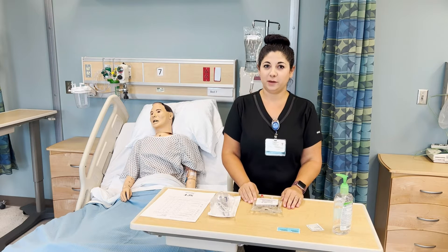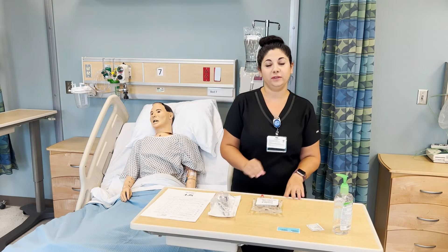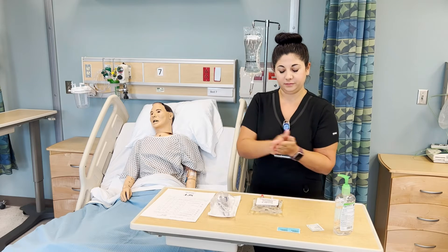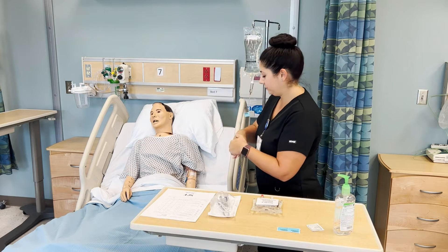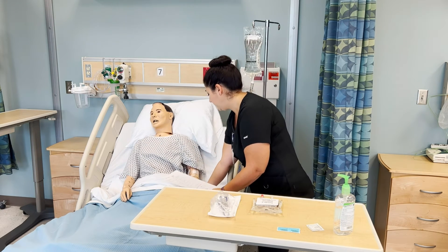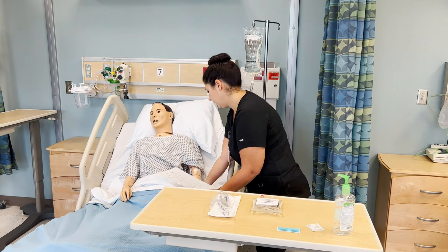I have knocked on my patient's door, entered, introduced myself, and explained to my patient that we are giving an IV piggyback medication. I'm going to wash my hands and identify my patient, bringing my MAR to the bedside. Can you tell me your name and date of birth? And do you have any allergies?